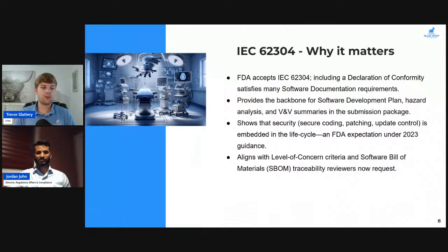Now, I know when we're going through the process, there's usually a lot of documentation that's required from that cybersecurity lens that isn't generated in other ways. And so when we're looking for documentation, I'm interested to hear what you think is going to be valuable as an output of the software process, and then where we're going to need to look elsewhere for that cybersecurity documentation.